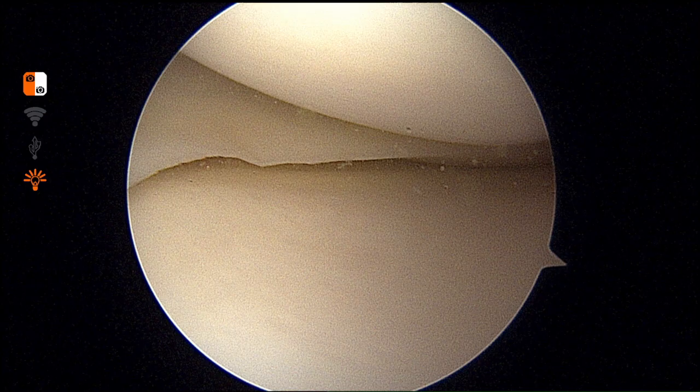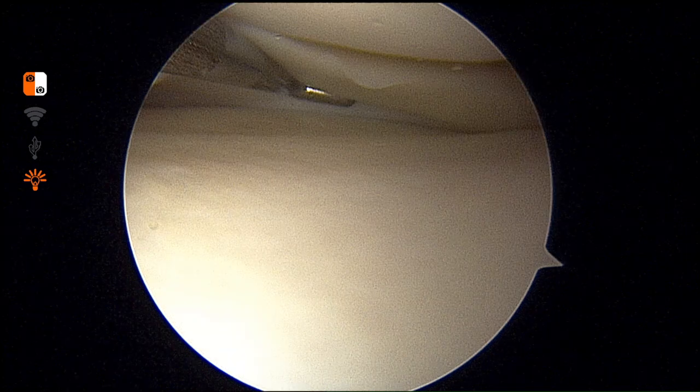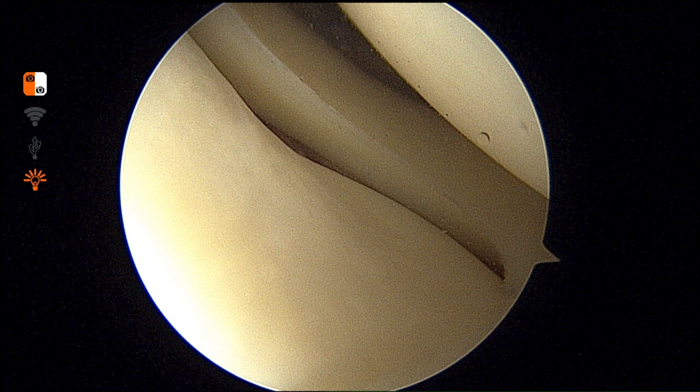Diagnostic arthroscopy is performed to exclude the presence of any intra-articular extension, which would otherwise be managed according to the tear characteristics. Using a blunt probe, the meniscus can be assessed. Here, the meniscus can be seen to be rolled using the arthroscopic probe. The posterior horn demonstrates an enlarged convex border.